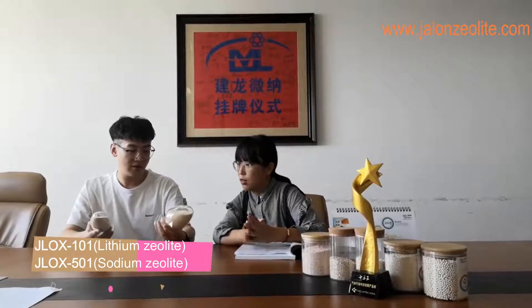So which one is lithium and which one is sodium? Because they look very similar. Yeah, they just look similar, but the performance is different. Oh really? Could you tell me the difference between these two products?